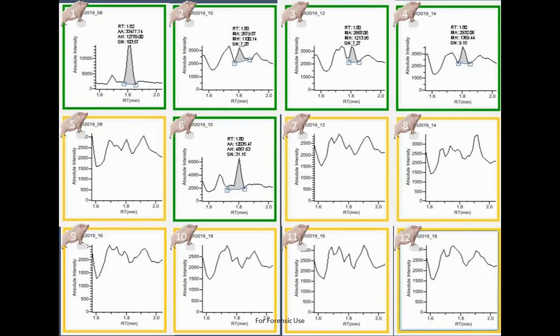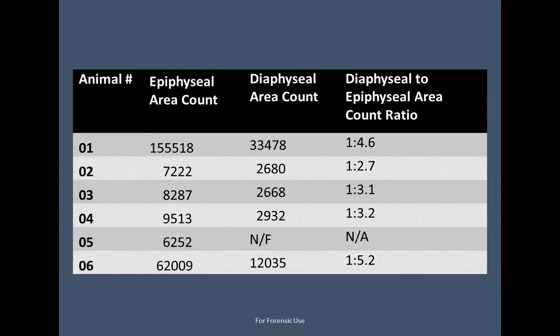And so we get confirmation that 1 and 6, those that died from acute exposure and acute response, definitely were positive in this bone matrix for what would be present. And we can call this a reason why they had passed away. Why these two, I don't know exactly why these two would have had this effect. Could be they metabolized it faster. It could be the exposure was slightly different based on that dermal approach, but we don't know. But at least we know that we can detect and confirm that it was present based on those two samples.